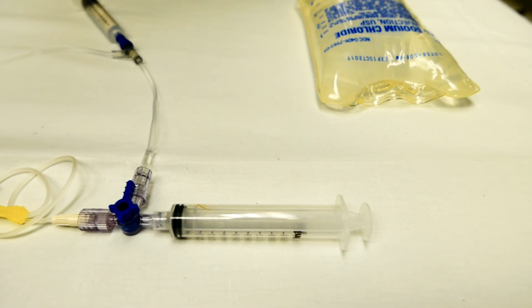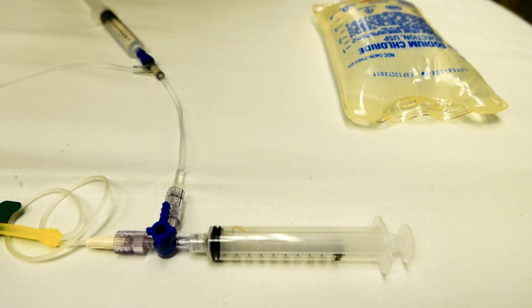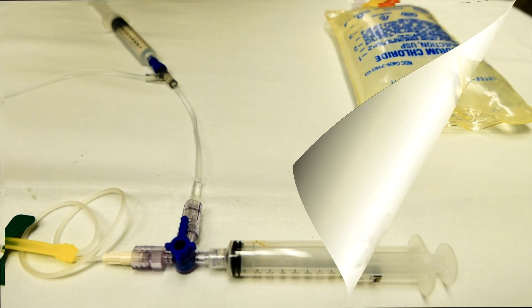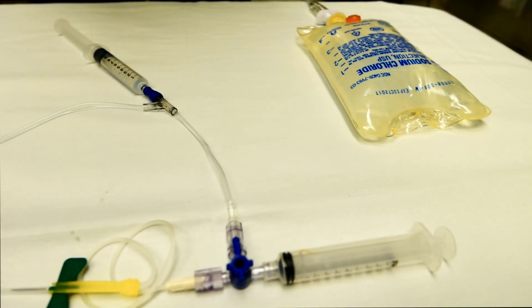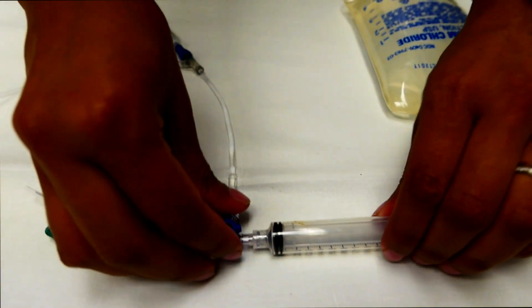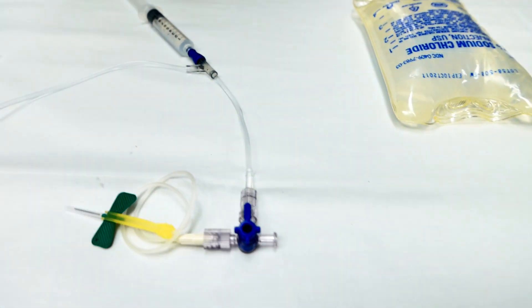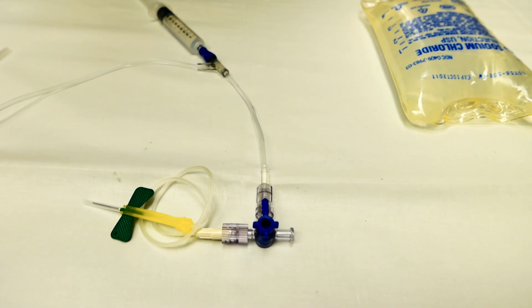This 10cc syringe is used to actually aspirate from the penis once you get blood flow. The first syringe you hand off to the nurse to get a venous gas, then you connect another one and aspirate some more.